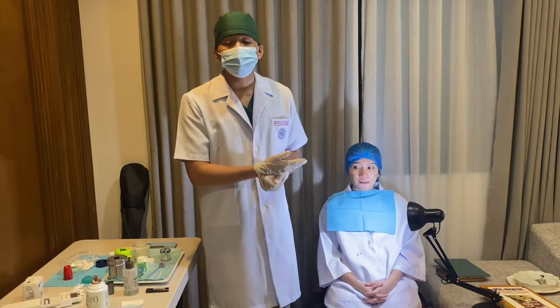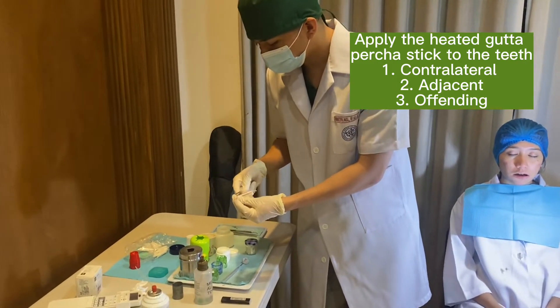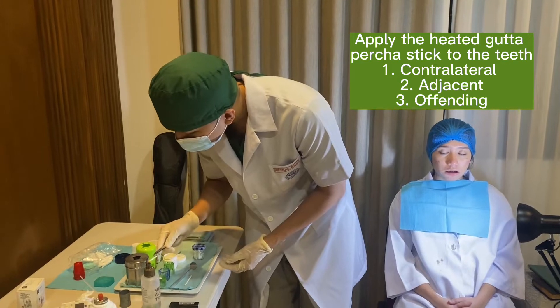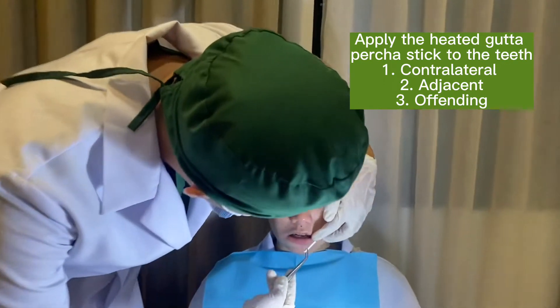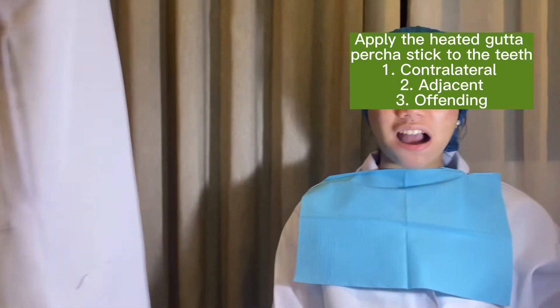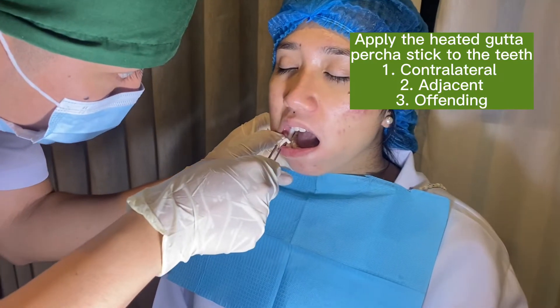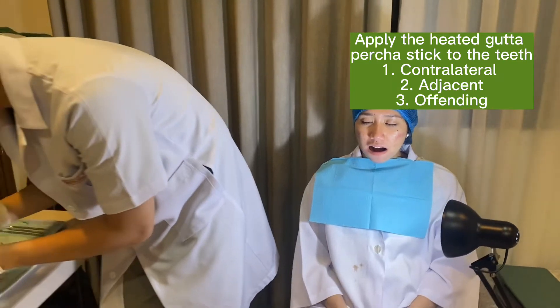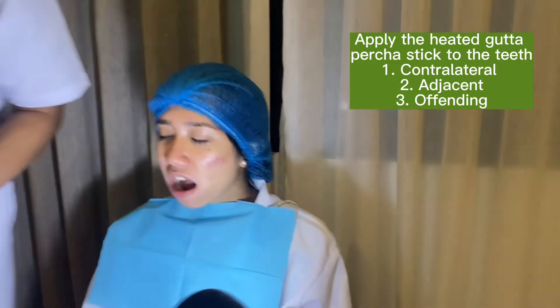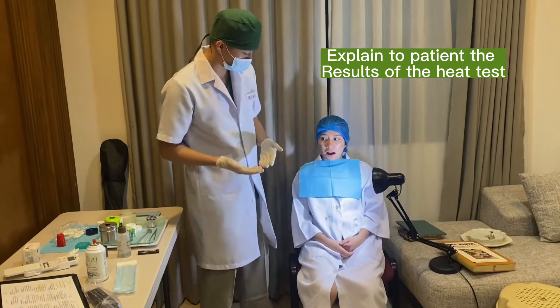I will now be putting petroleum jelly first. Now that I've put petroleum jelly on the teeth, I will now be doing the heat test. So all your reactions are normal — it indicates a normal, healthy pulp. It's responding to the test, both the cold test and the heat test.